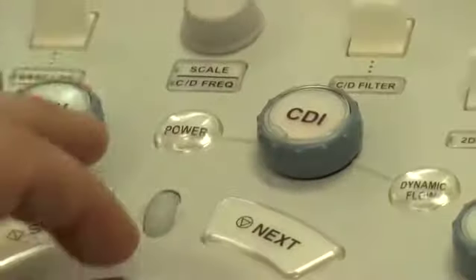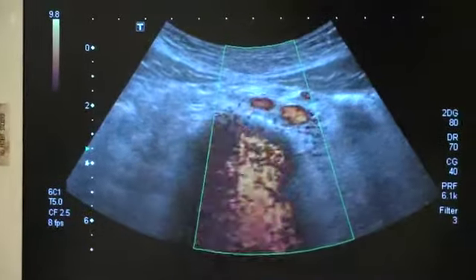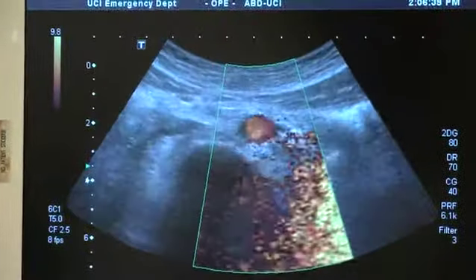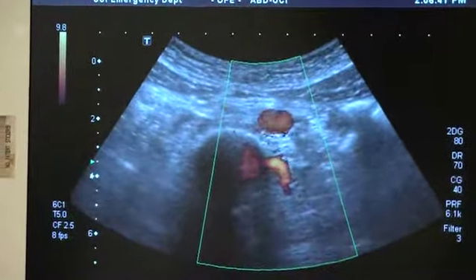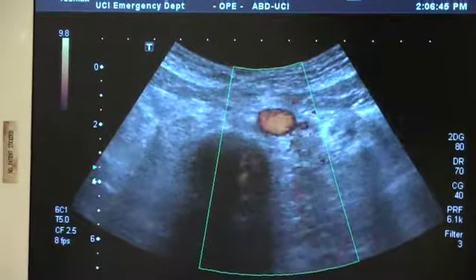The power Doppler is in between. That's one color, and it doesn't tell us which direction the flow is going. It just tells us if flow is there. We use power Doppler a lot because it's less dependent upon imaging angle, and it's more sensitive to low flows. You can see it's more sensitive because it's picking up flow from everywhere. It's picking up motion artifact everywhere.